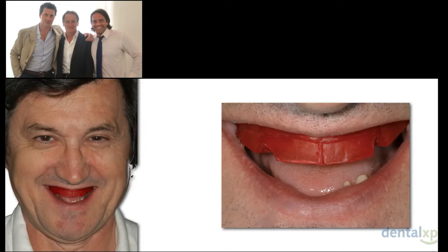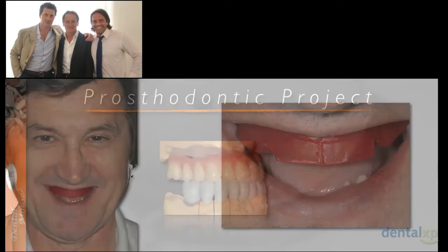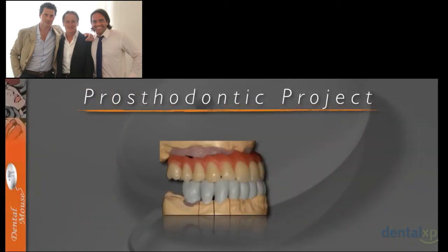From there he's gonna do a hypothesis of prosthodontic project based on the lower temporary that he knows is always the same, and you see the diagnostic wax up, how important it is. He's gonna do this hypothesis of upper arch project that we're gonna try in the mouth once Luca thinks that all the details are okay, the static details, the occlusal details are good.